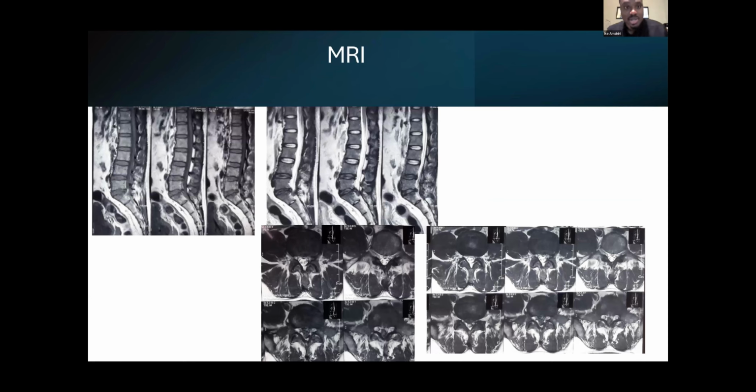Yeah. Thank you, Dr. Bishnu. This is obviously a very interesting case for all of us. Cauda equina syndrome, again, we treat as an emergency here. My question to you, and you mentioned this in the beginning of your talk: the reason people may shy away from using endoscopic techniques while managing cauda equina syndrome is difficulty confirming adequate decompression. What are some of the things that you do to avoid an inadequate decompression or to confirm that your decompression is adequate?